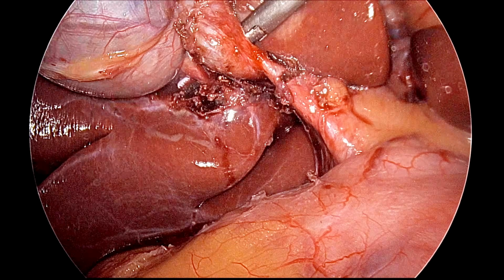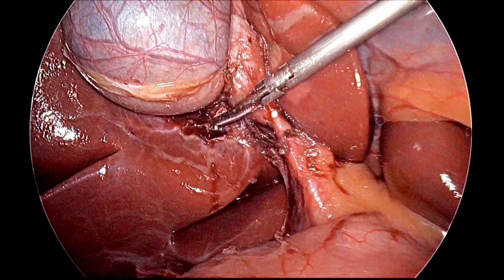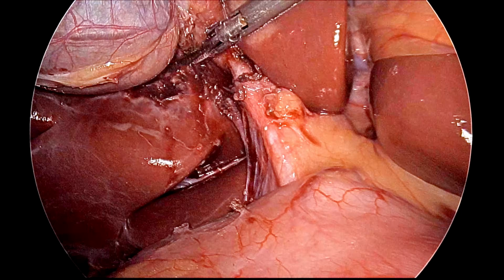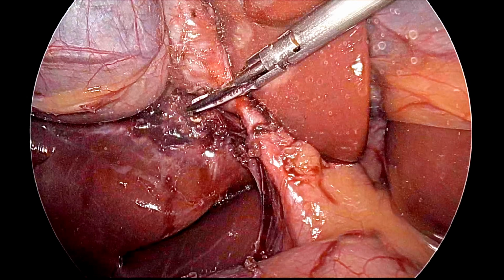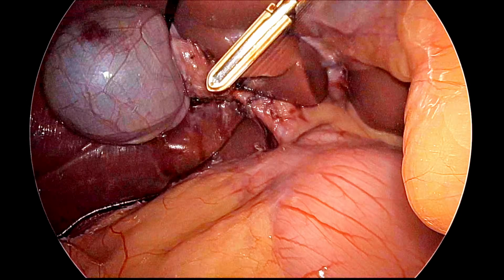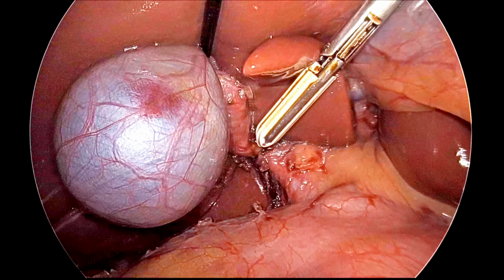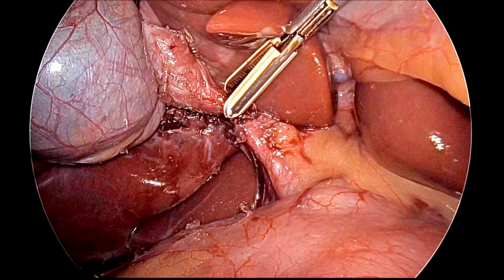So now it is better that you should completely free the posterior structure to make sure that there is no other structure, no double cystic artery, no duct of Luschka. And now we will use the ligature again to seal the duct. This is the nipple effect. Once you relax, you can see it is going towards the gallbladder, and then you can seal the duct.